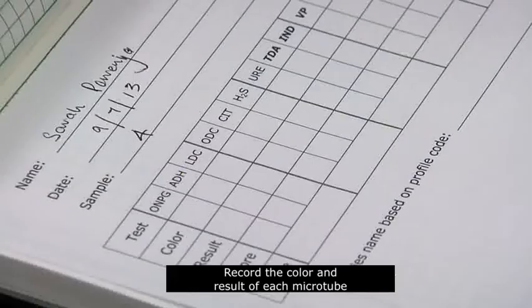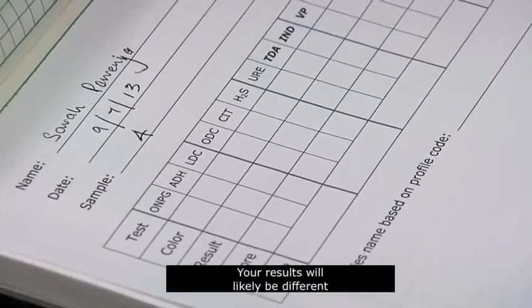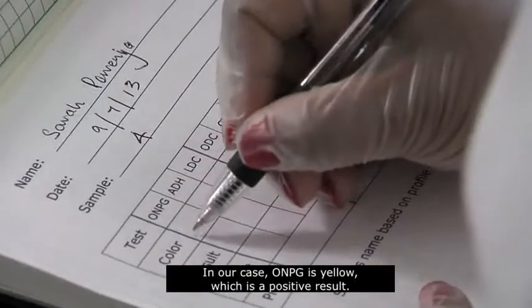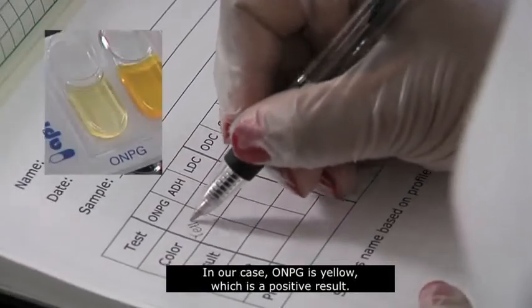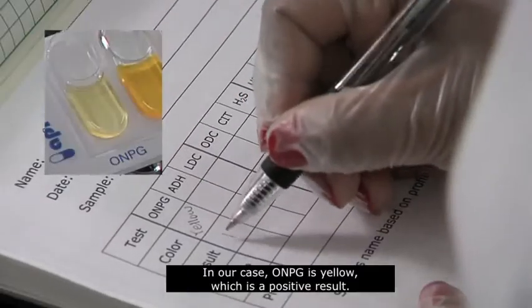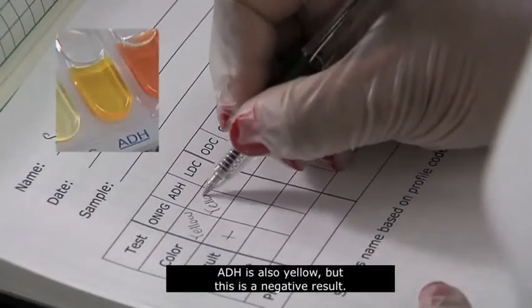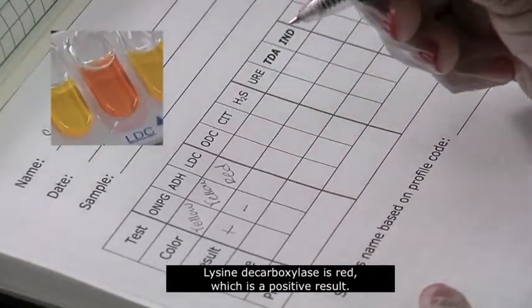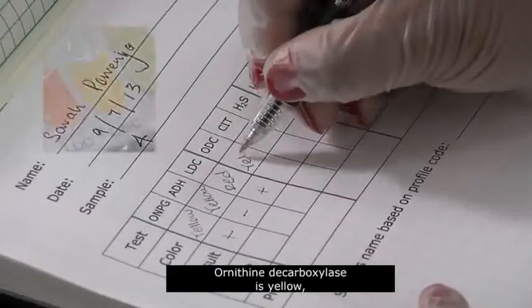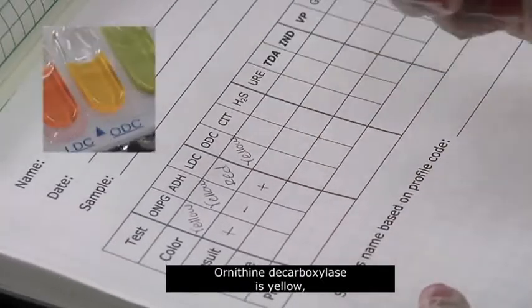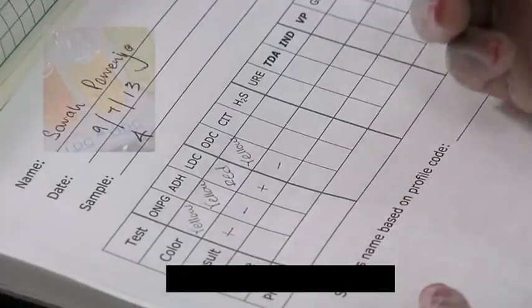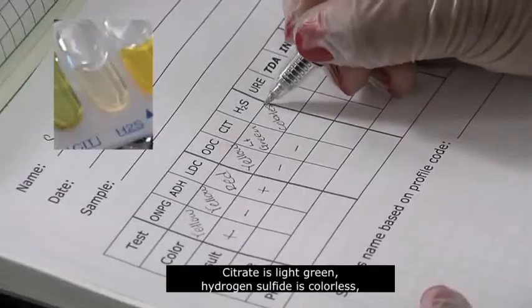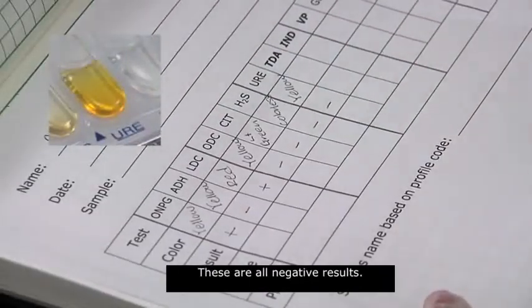Record the color and result of each microtube in your results table. Your results will likely be different from the specific results we show here. In our case, ONPG is yellow, which is a positive result. ADH is also yellow, but this is a negative result. Lysine decarboxylase is red, which is a positive result. Ornithine decarboxylase is yellow, which is a negative result. Citrate is light green, hydrogen sulfide is colorless, and urease is yellow. These are all negative results.